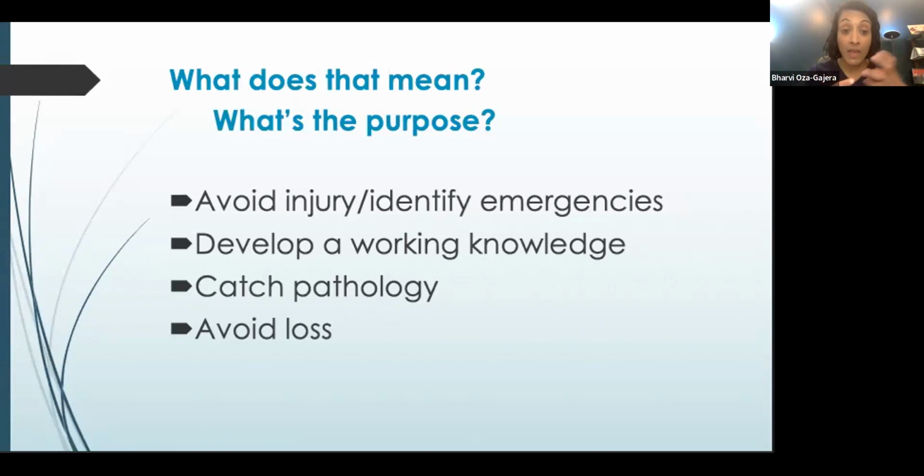You can get a bad infiltration and it can cause edema that resolves, but the access gets pushed a little bit to the side, or they develop scar tissue that ends up being problematic. Or even if it's not problematic, it still affects the blood flow rates. So we really want to try to avoid cannulation injuries.